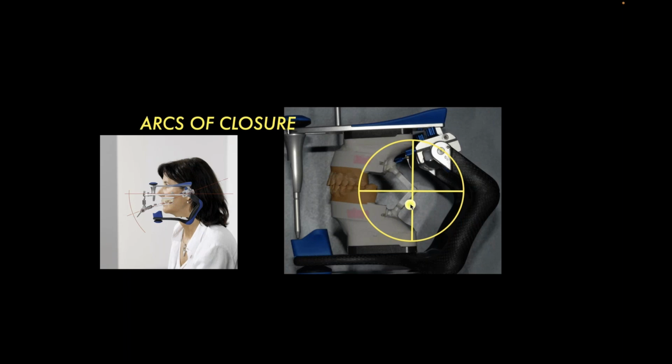So if I open and close the articulator from that point, I get a certain opening and closing. And you could do it from the upper or lower. Obviously, the lower is the tooth that is closing, but we usually open the upper member of the articulator. But watch what happens when I show you the center of rotation from a real instrument or from the human. Look at how much different that arc becomes.